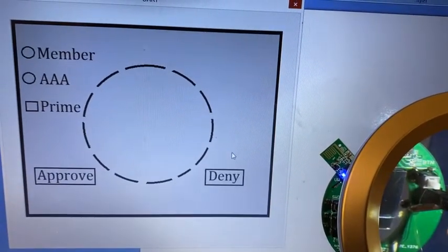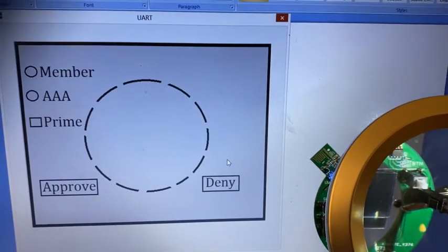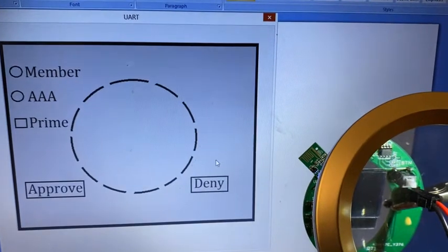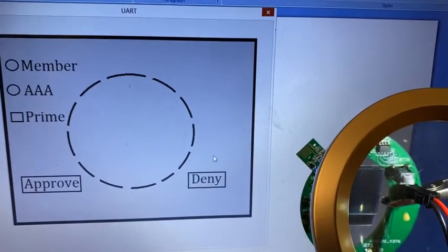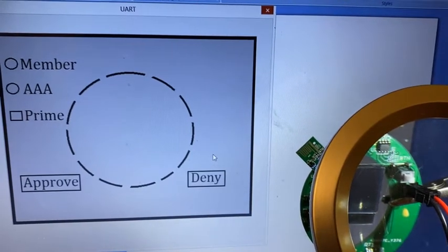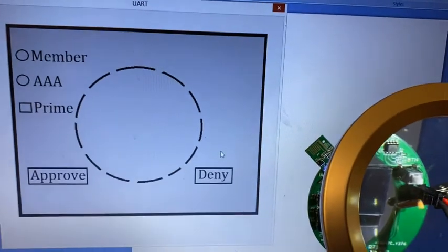These are selectable UI components. Below, you can see approve and deny buttons, which are selectable and triggerable. Triggerability implies, in this case, the ability to generate an event within the system that will get percolated to an event handler within the application, and appropriate action will be taken.